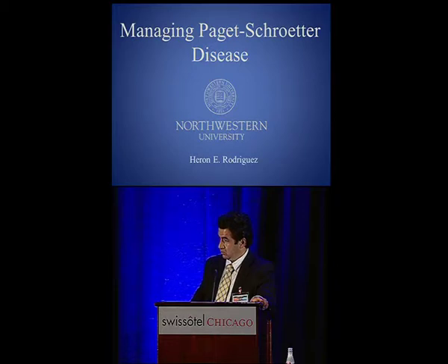So Dr. Amaya said to me, I bet you can't do anything with this. I'm sure it's impossible. I said, well, we could try. And I just want to point out that we were actually able to get a guide wire to go through the actual clip after we figured out the anatomy, which took about a day of lytic therapy because it was a year old.